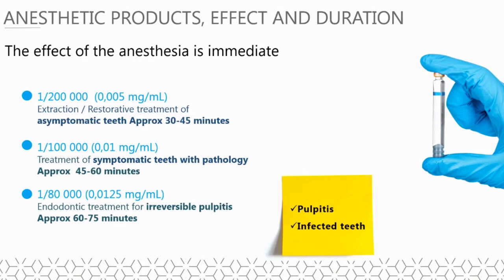To optimize time, it is a very good idea to plan the anesthetic act before the patient enters the clinic and have everything ready to start working as soon as the anesthesia delivery is complete.